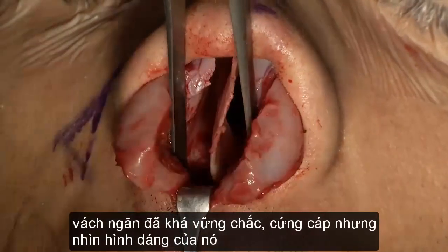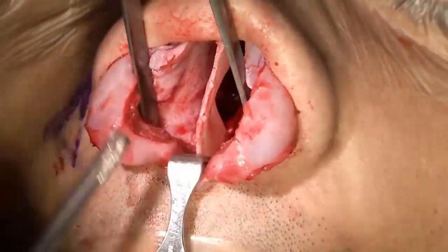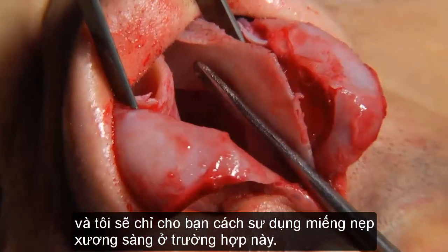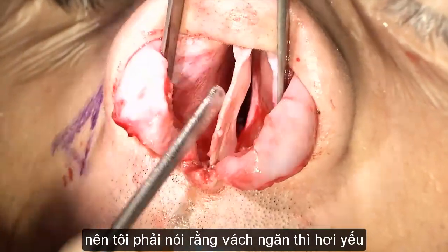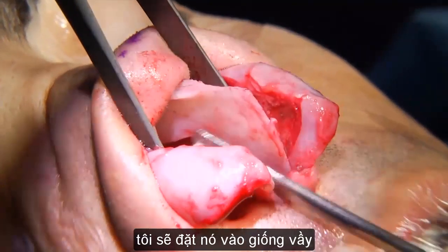So this thing is solidly here, but look at the shape of this septum. It's a little bit weak, so I will show you the use of an ethmoid splint this way. I was saying this septum is a little bit weakish, so I will show you the splint like this. I will place it like this.